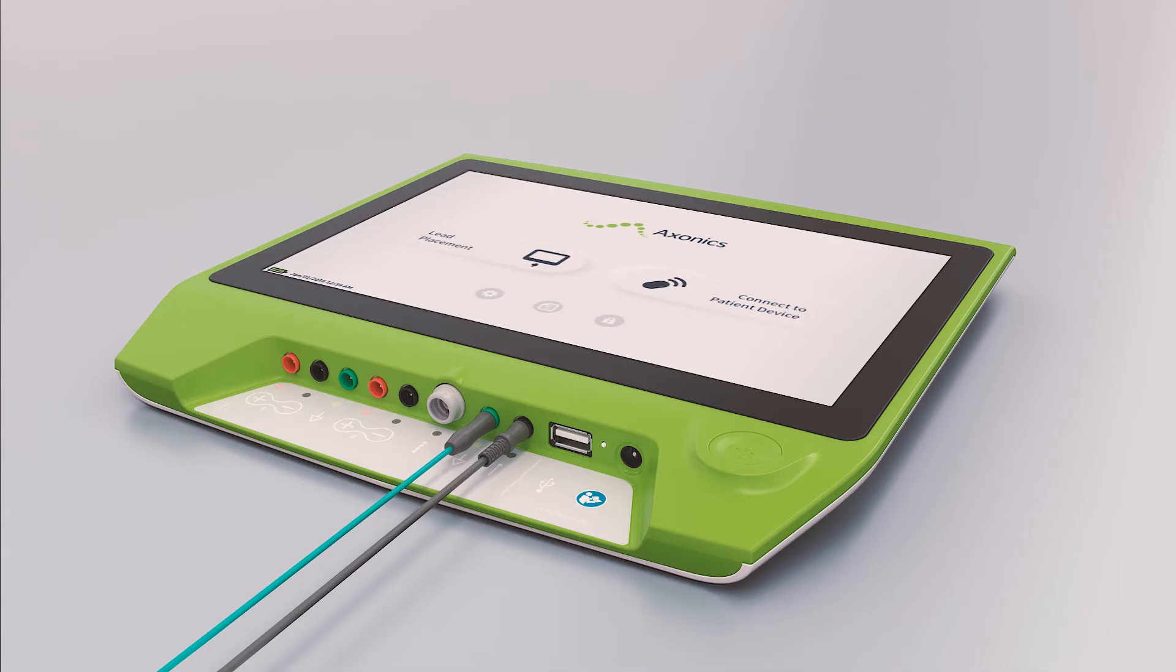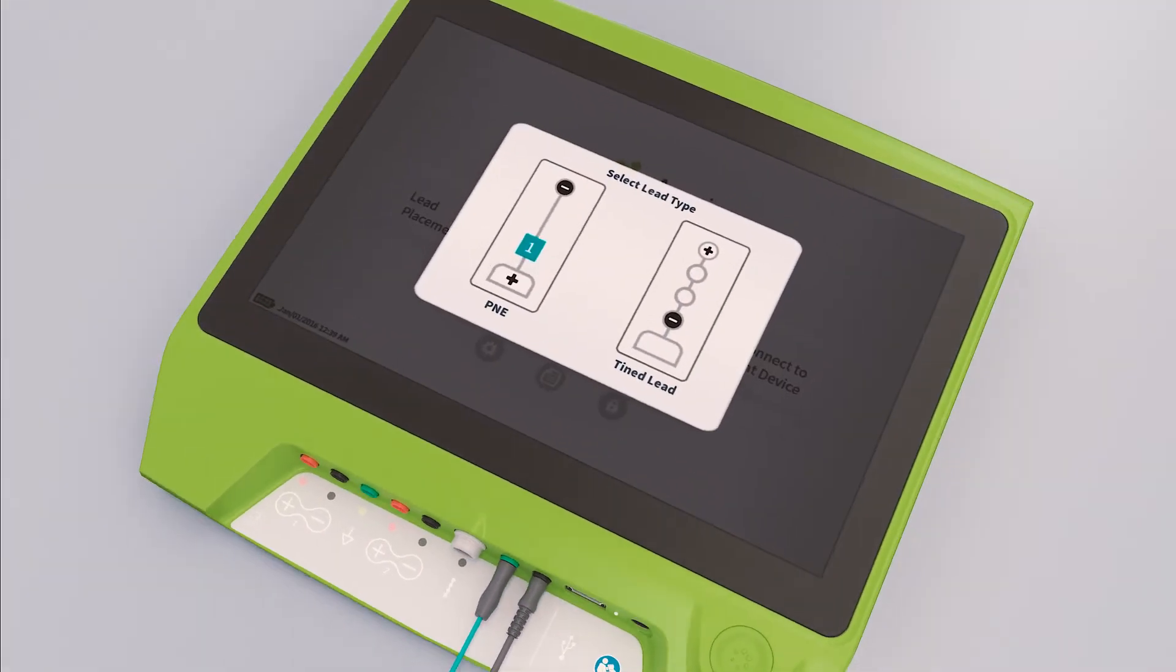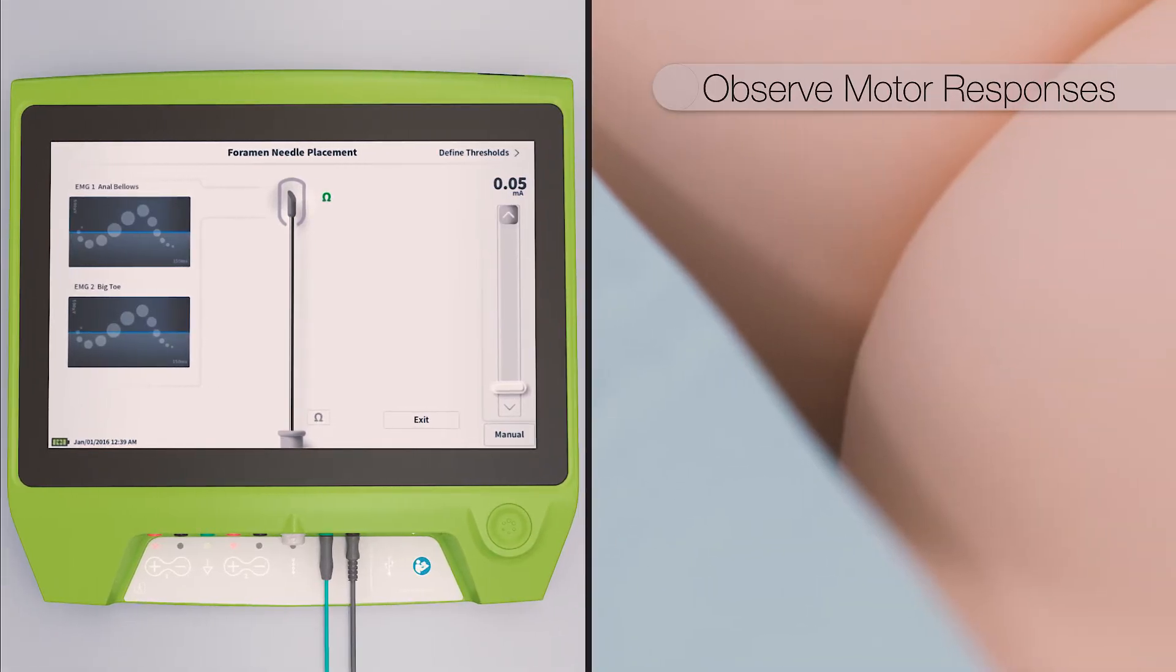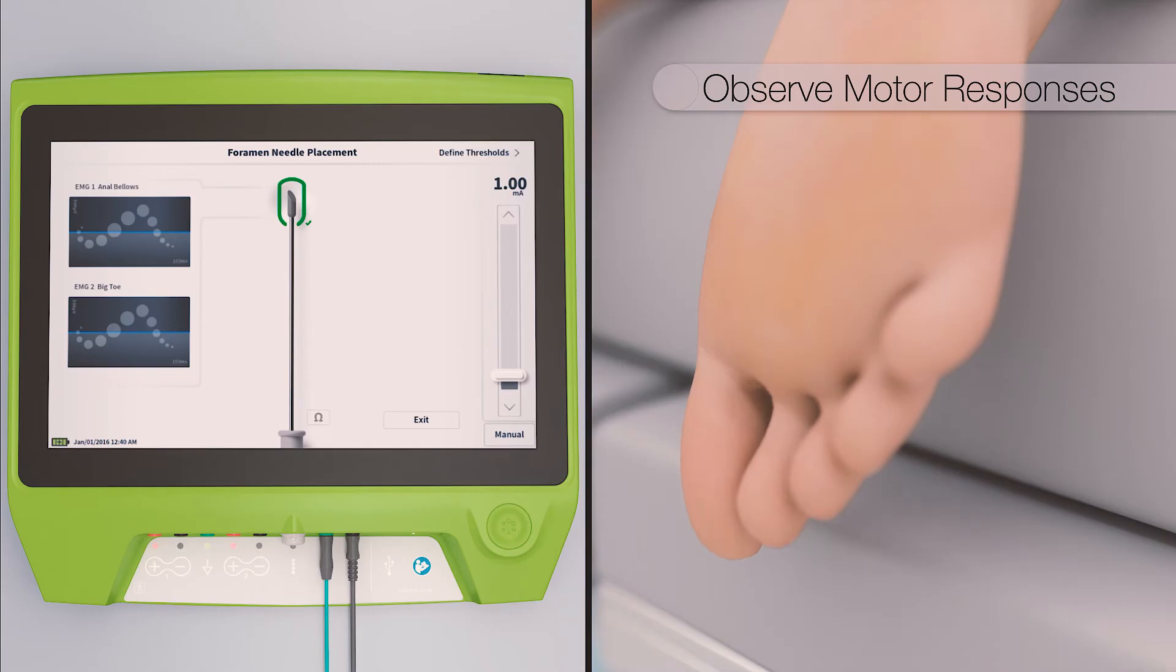The clinician programmer is used to provide stimulation to test for patients motor responses. The ideal motor response is a pulling in of the pelvic floor muscles also referred to as a bellows response at an amplitude below 2 milliamps with toe flexion occurring at higher amplitudes.